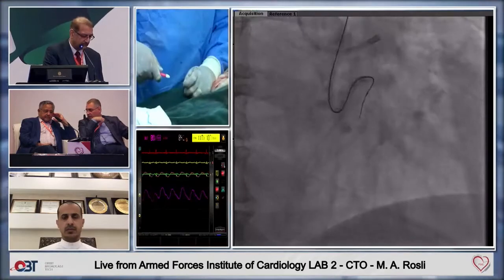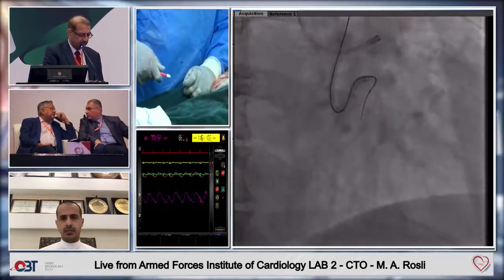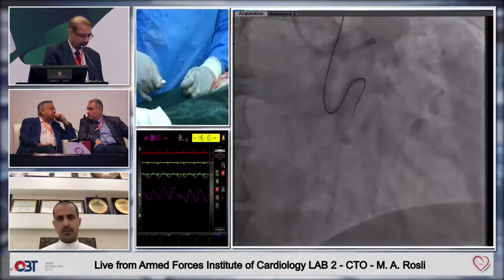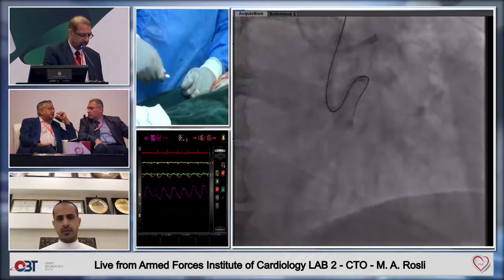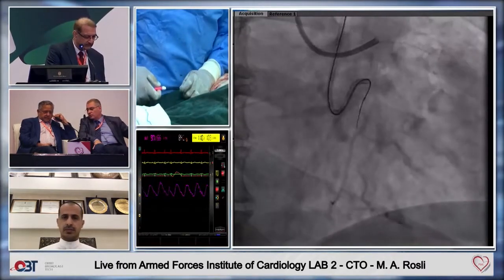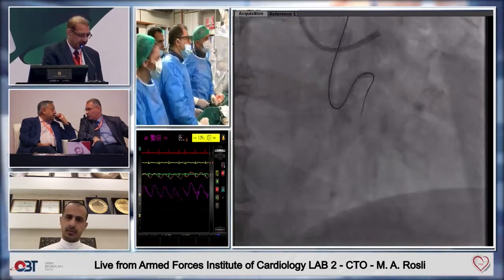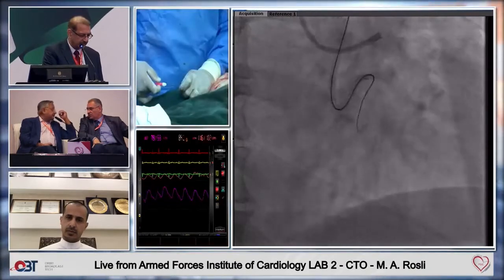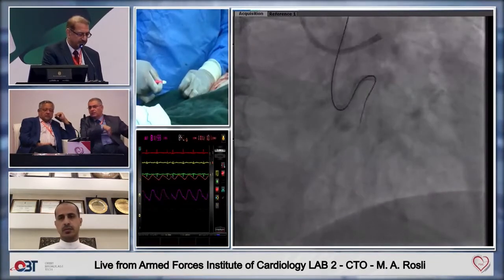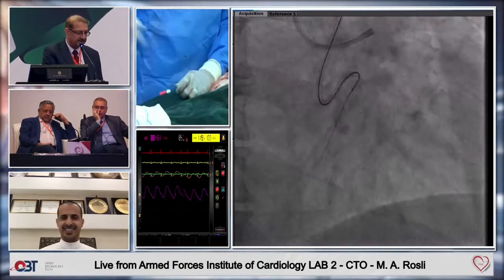Now I'm touching the plaque again, proximal cap, and I try to push a little bit down. I think I penetrate the proximal part. Okay. Injection, please. No. We're not okay, sure. I'm not far from the distal cap. We have a side branch there. Yeah, at least we are in the true lumen, it looks like. Yeah, true. I think we cross now. That's very nice. Okay. Very good.